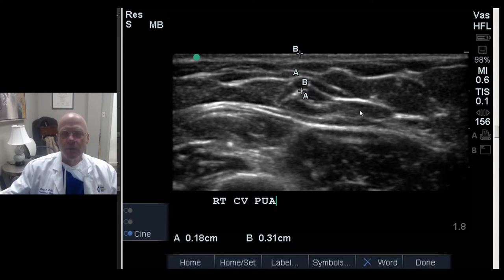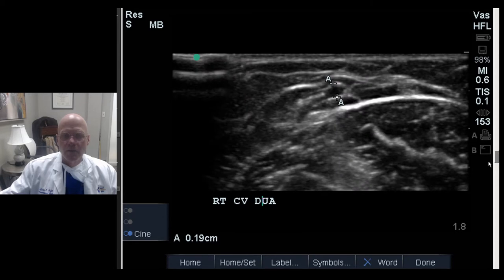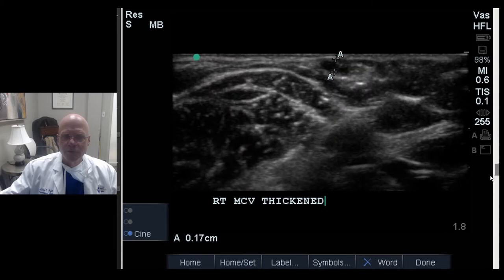This is a fairly typical mapping that we perform. This is the cephalic vein in the upper arm. You can see it's only 1.8 millimeters in diameter, so fairly small. As we move down to the middle arm, you can see not only is it small, but it's deep. It's only 2 millimeters in diameter, and it's 4.6 millimeters deep. Then in the distal upper arm, 1.9, so still small, visible all the way down.